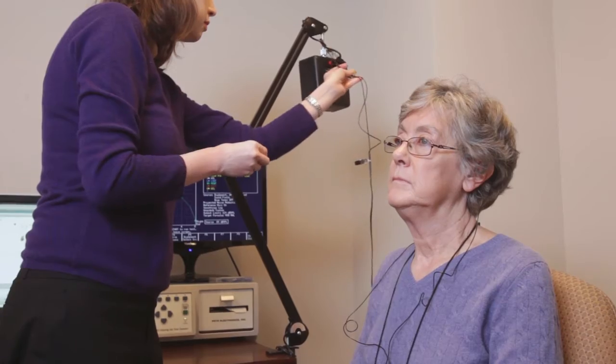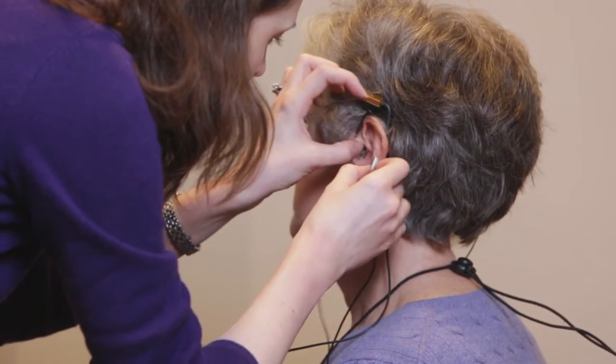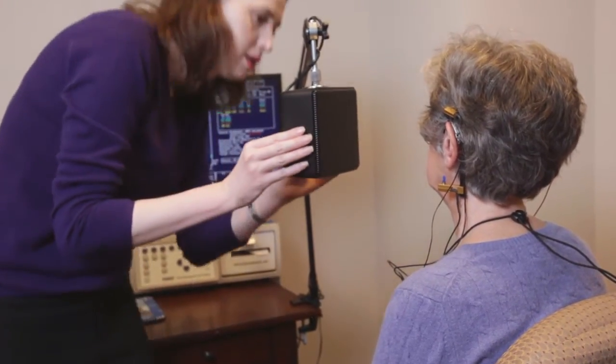Real Ear Measures are something that we do with every new hearing aid fitting and periodically during the life of the hearing aid to make sure that the hearing aids remain in calibration. For that procedure, what we do is we put a microphone over top of the patient's ear and put that little tube down in the ear. We play some sounds and look at the type of response that we're getting.